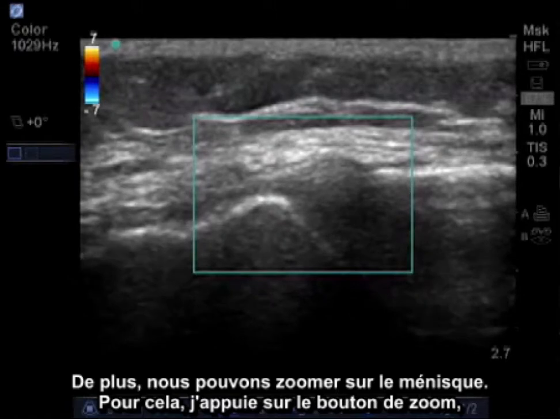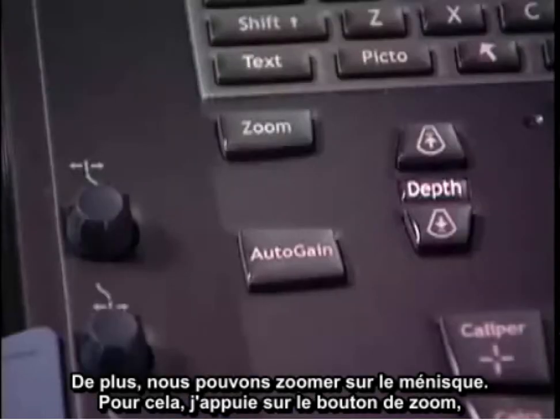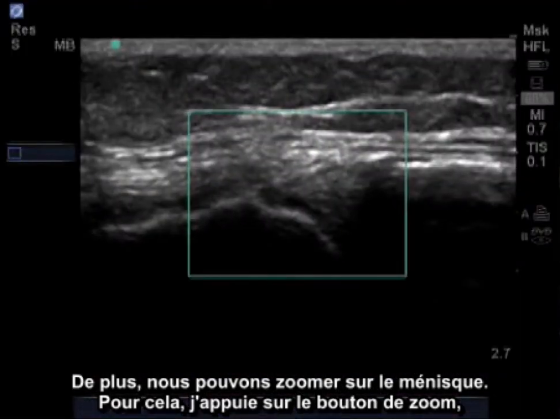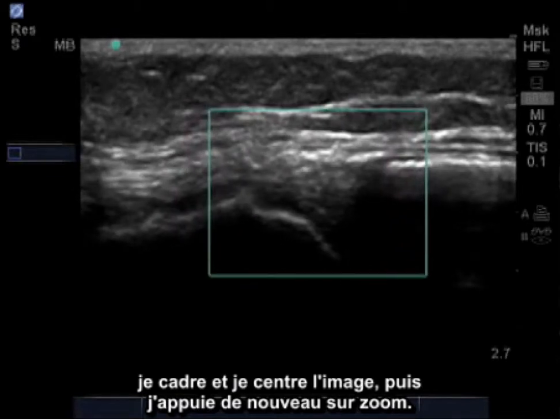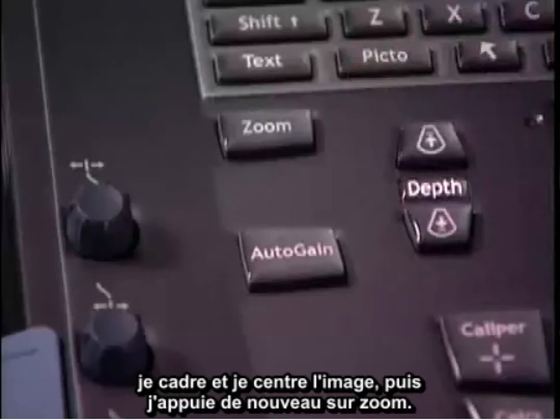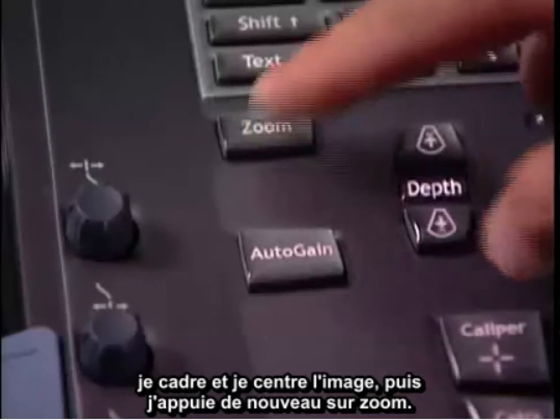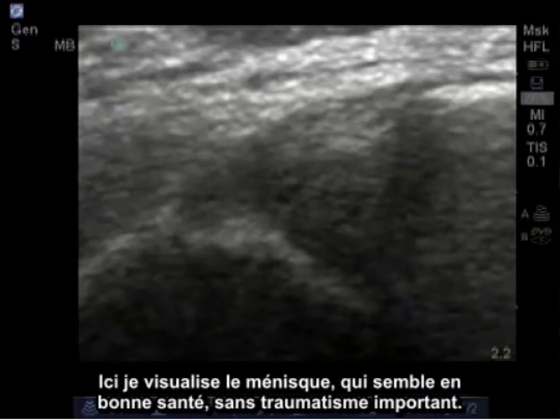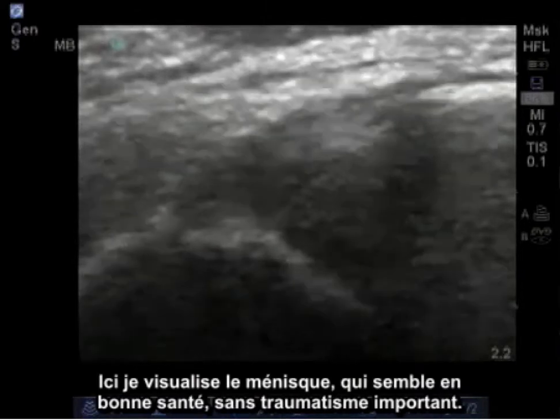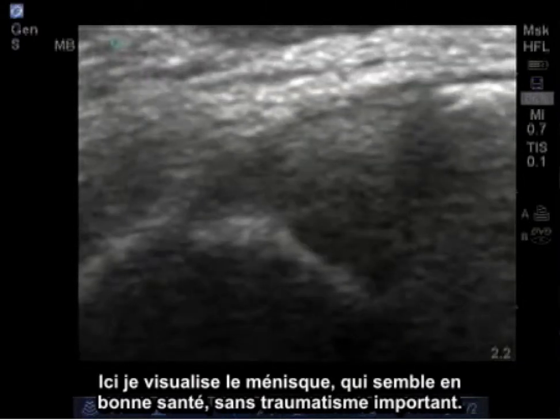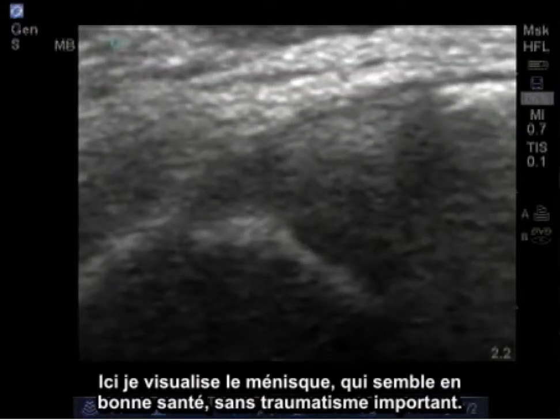In addition, we can zoom into the meniscus. I do this by pressing the zoom button, squaring the image, centering it, and pressing the zoom once again. And here, I visualize the meniscus, which appears healthy with no significant trauma.